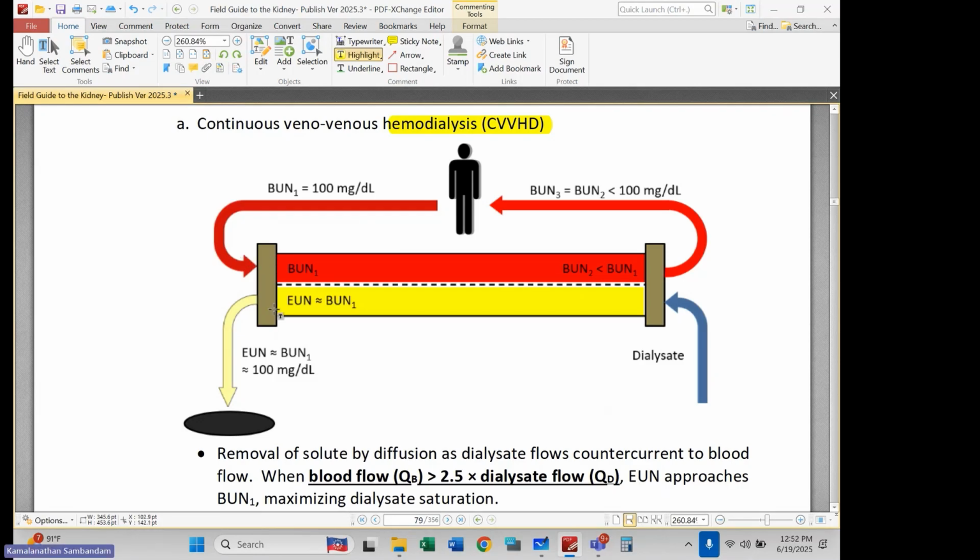Remember, I told you the KoA, that's the maximal urea clearance by a dialyzer, is typically factors higher than what we demand, right? We're typically getting urea clearances of 300 mL per minute or less on intermittent dialysis. And your KoA, that is your maximal urea flux for a typical dialyzer, is around 1,000 milliliters per minute. Okay, so several fold more than you demand from it.